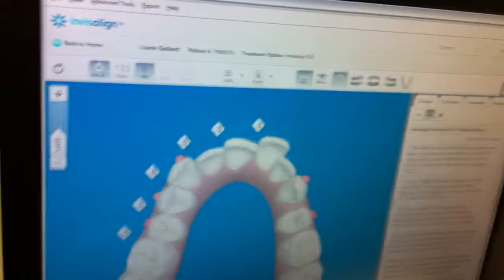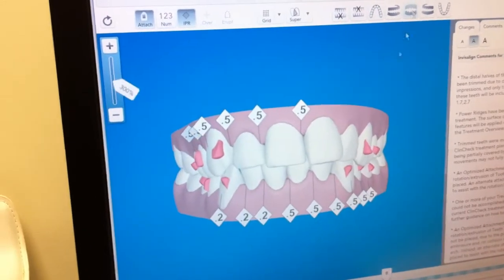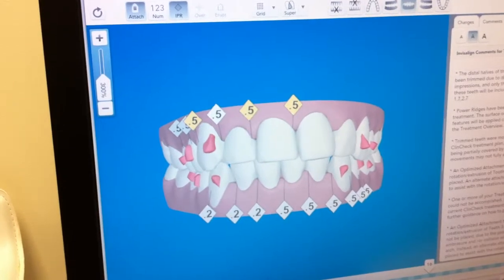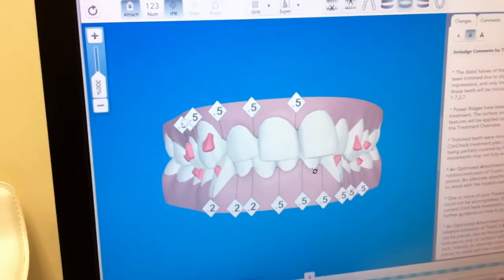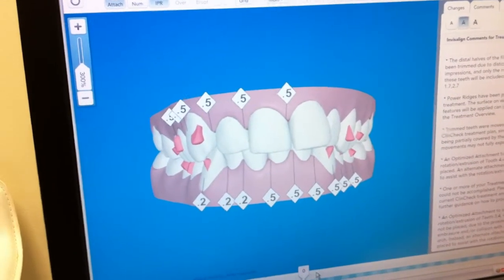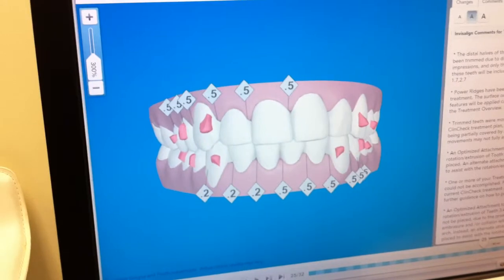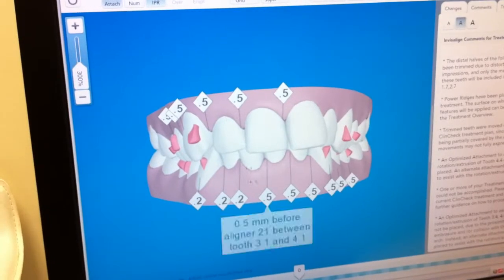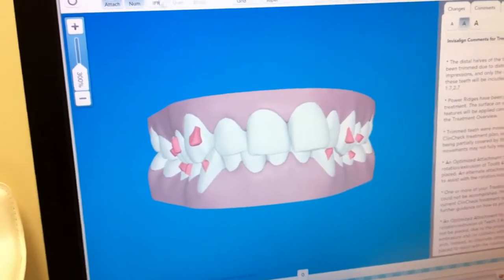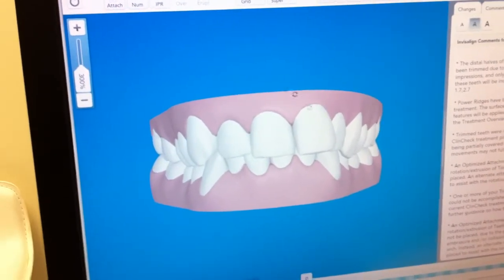Here we are — this is your virtual animation of your movements. Let's go from the beginning and look at your frontal view. Let's pause this. Okay, again the frontal view, back at the beginning. So this is how your teeth look at the beginning. I'm just going to grab this little button here and move your teeth — it shows the movement of your teeth from the frontal view. So that's what it looks like at the final result. Let's remove a few little things here so we can see better — remove the attachments, remove the numbers. Okay, so that's the frontal view.